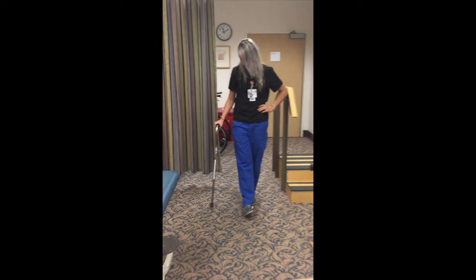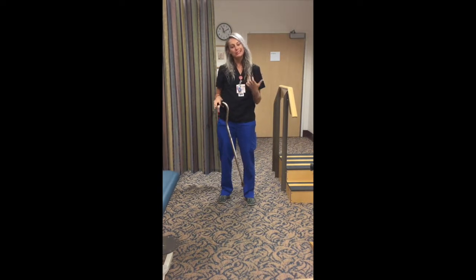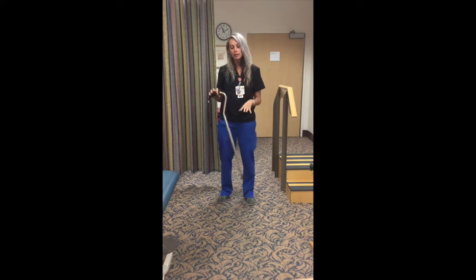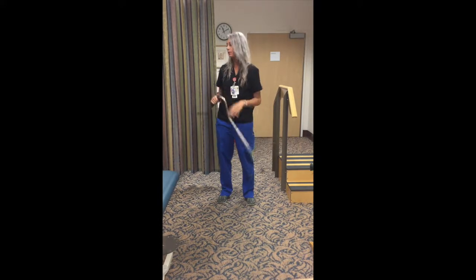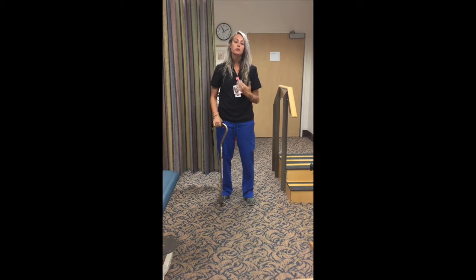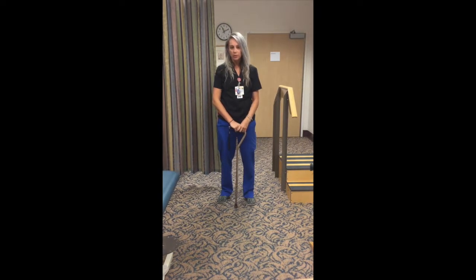Go ahead, Christy. Okay, so to be effective with the cane, you need to be able to tolerate, say, 90 to 100% of your weight on your operated side. The cane itself is not designed to take weight off like a walker is. So if you're going to effectively use a cane, you need to make sure that you're walking well without the walker, as in not having to put any weight through your hands.